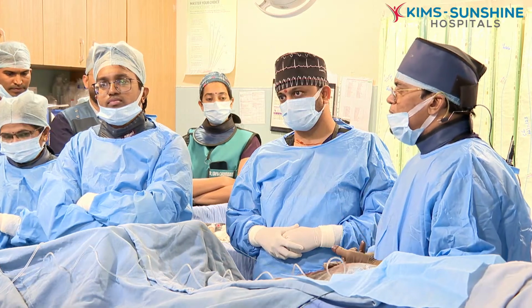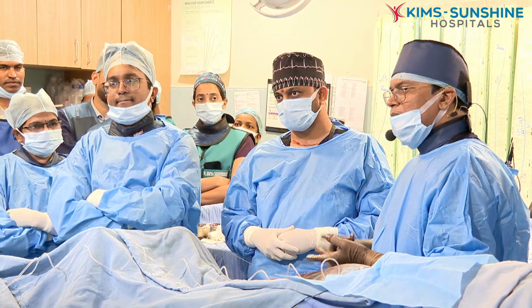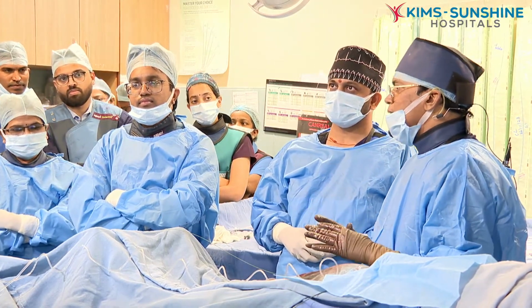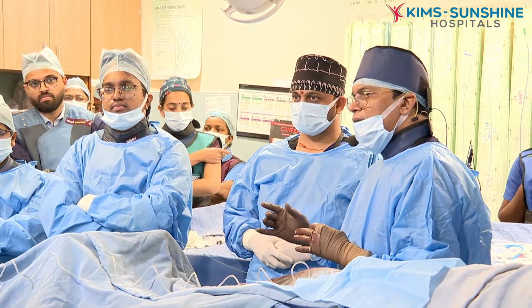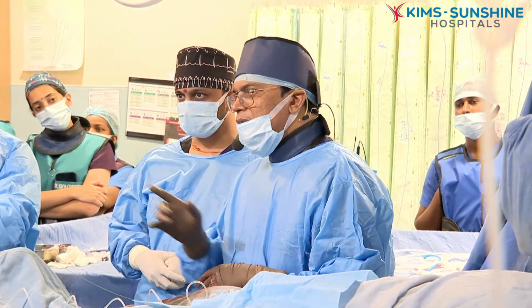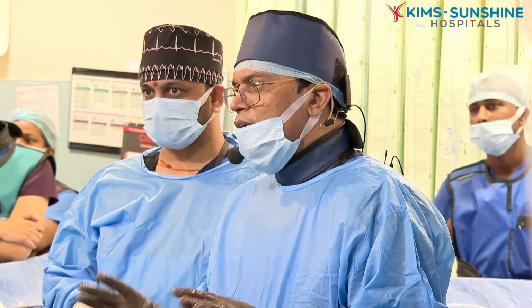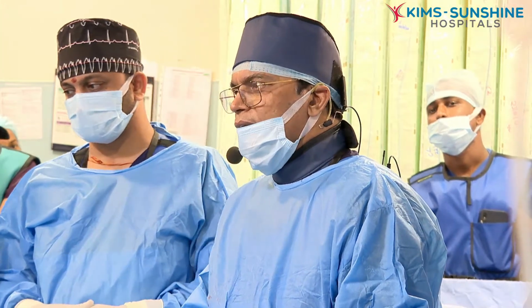For a calcium nodule in the LM, you can use IVL, you can use rotational atherectomy, you can use the orbital with equal efficacy. The only thing is, in a large lumen with an eccentric calcium nodule and not that critical a lesion, sometimes ROTA may miss because of the wire bias. That is the only hindrance. But in a very tight lesion, ROTA definitely ablates very effectively.